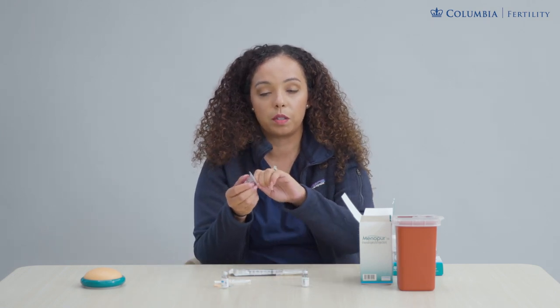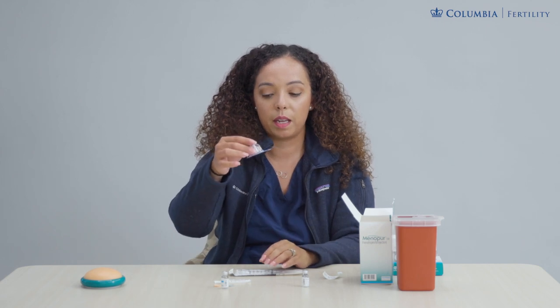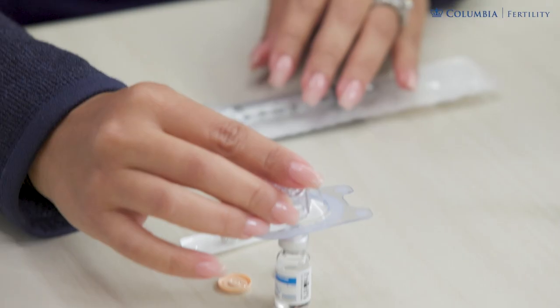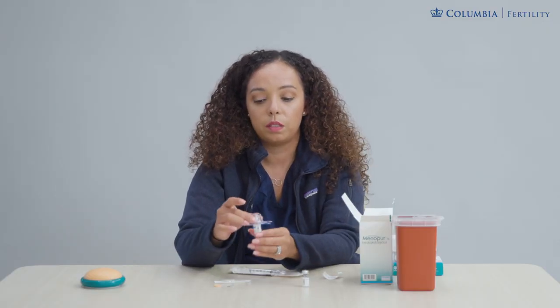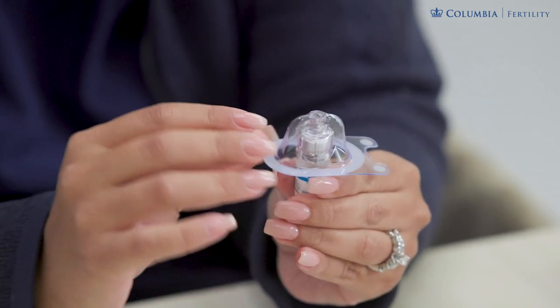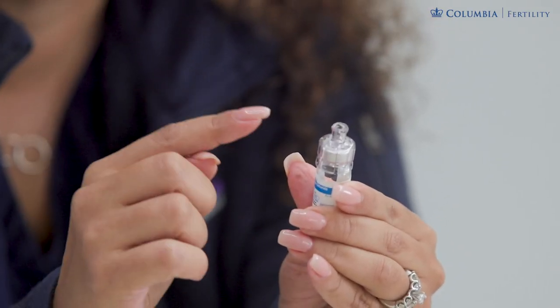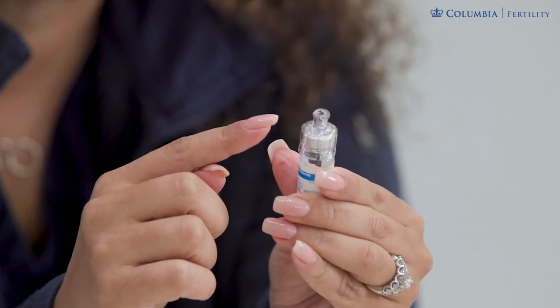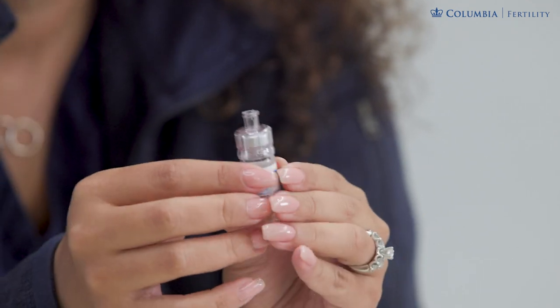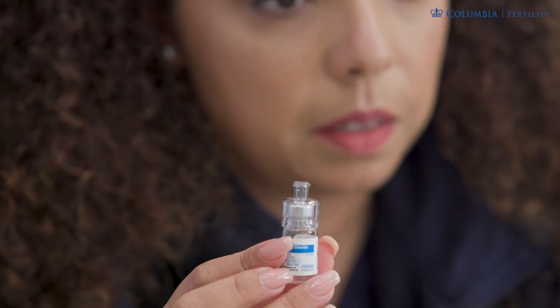Once your vials are cleaned, take your Q-cap device and open it up by removing the seal. Take the Q-cap in its plastic device and poke the top of your liquid vial. Once the Q-cap is on your liquid vial, remove the plastic around your Q-cap by pulling it right off. Your Q-cap has a little screw on top where we will screw on our syringe. Note that the liquid vial contains two milliliters of liquid, and you may not need all of it.